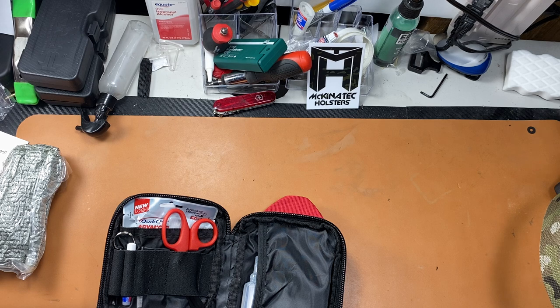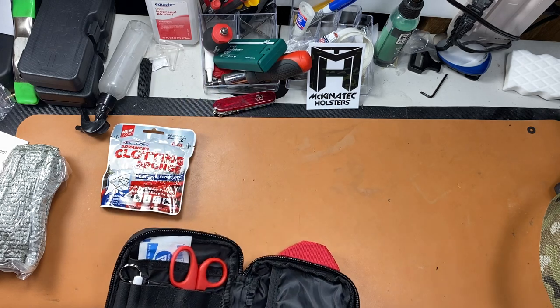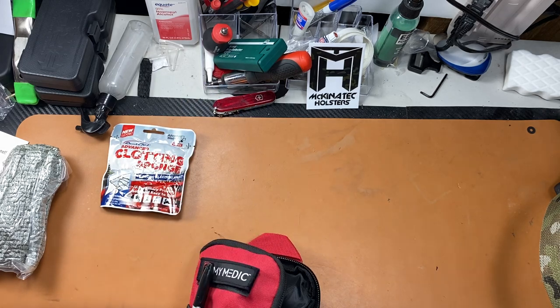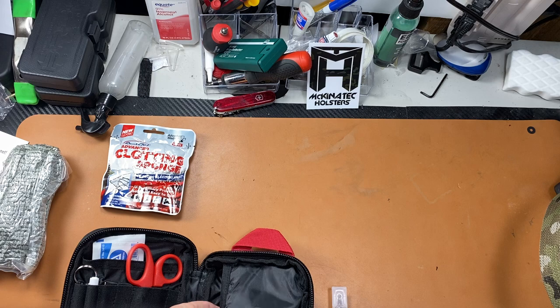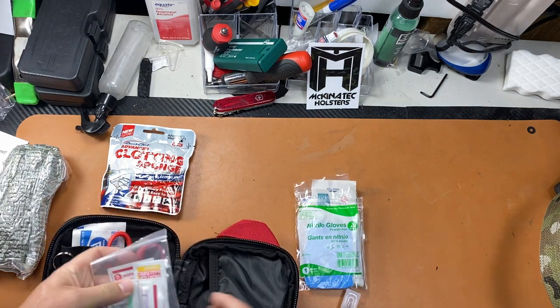Now it does come with a lot of things like scissors. There is an advanced version that comes with a RATs tourniquet and a QuikClot, both of which I added myself. The basic kit also comes with a large bandage, Steri-Strips, and a gauze roll. I'll pull out the items and go over what's included.